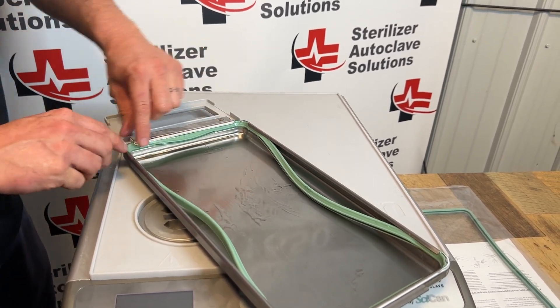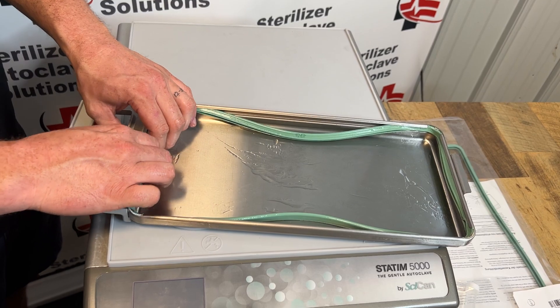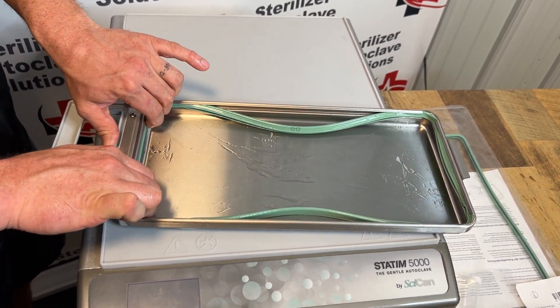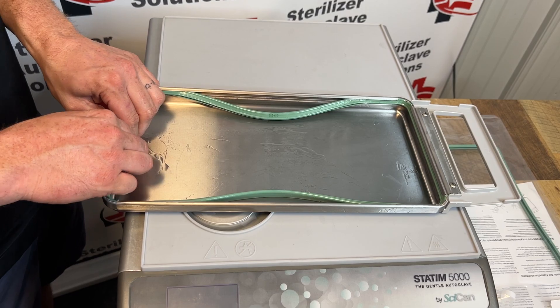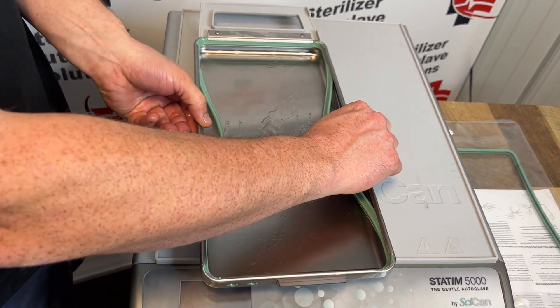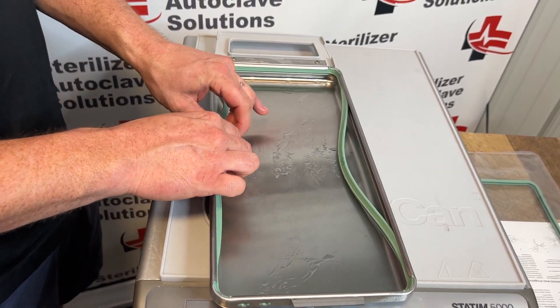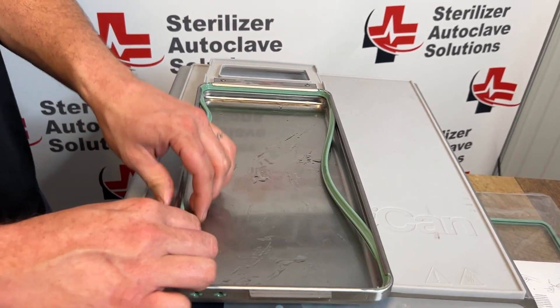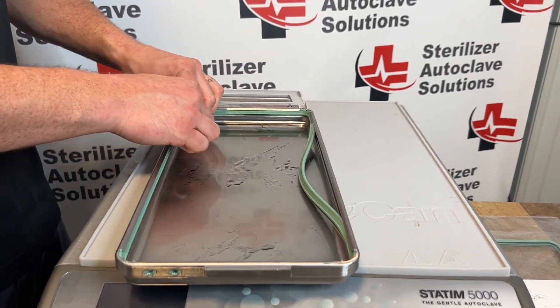Once all four corners are done and the nubs are in the corners, take it on the short side and just press that in. Go to the other short side and press into place. When you get to the long side, we're going to split the difference right in the middle, press that in, and work our way out. You will get bubbles — that is okay, it will slide into place.